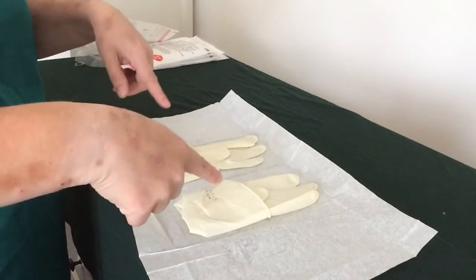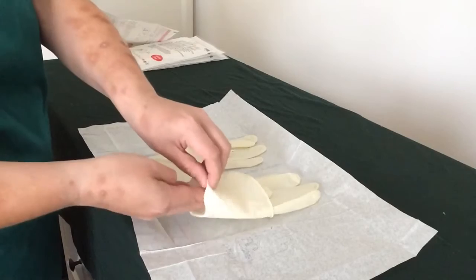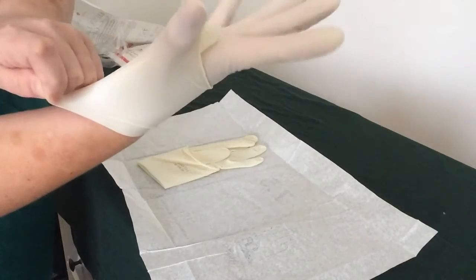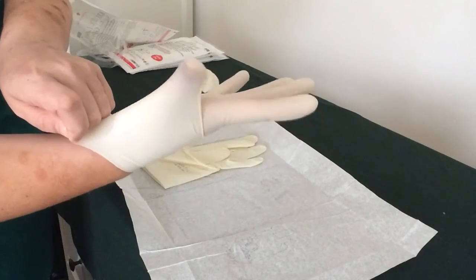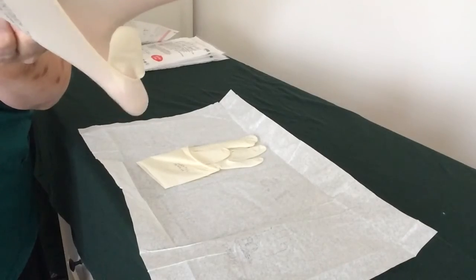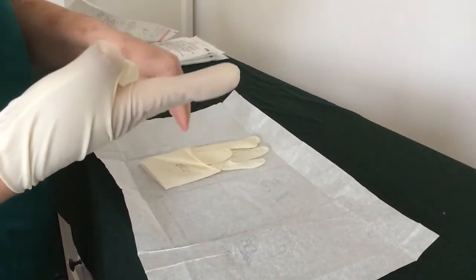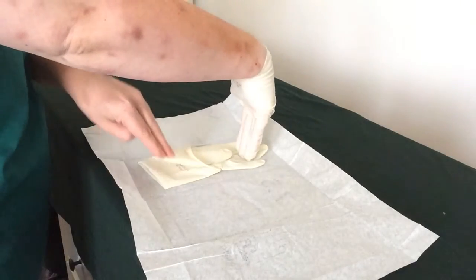I'm right-handed, so I'm going to start with my right hand — but it doesn't matter which hand. Picking it up with my left hand, sliding in, because I only want to touch the inside of the glove. I'm pushing my hand in slowly, keeping my thumb hooked under — I'll show you the reason for that later. So this is where a lot of people get confused: I can touch the outside of the glove to the outside of the glove.